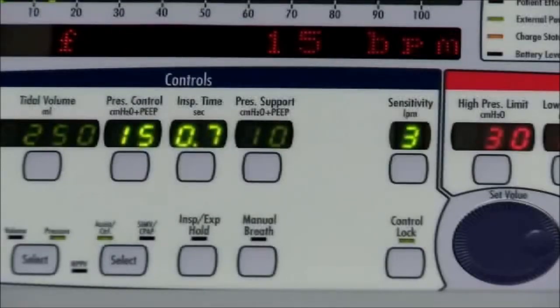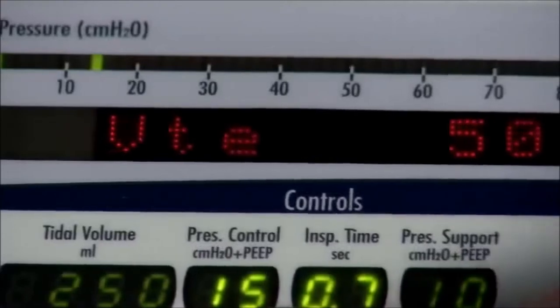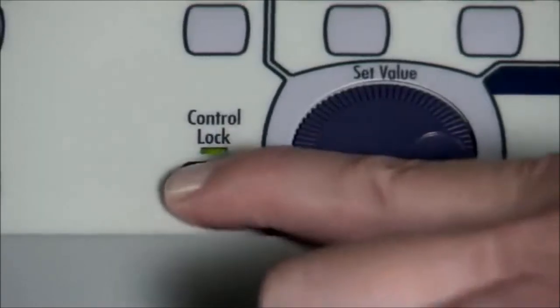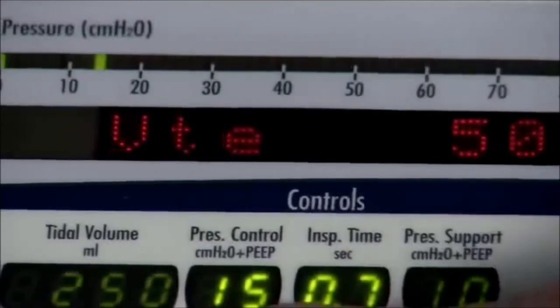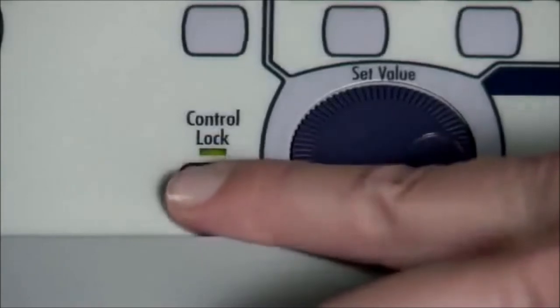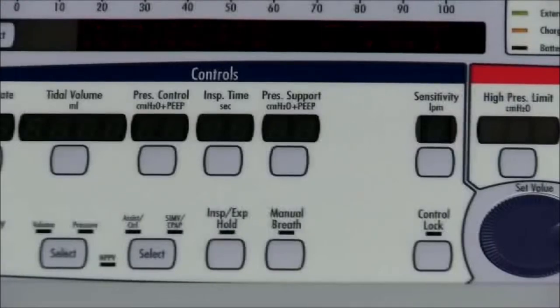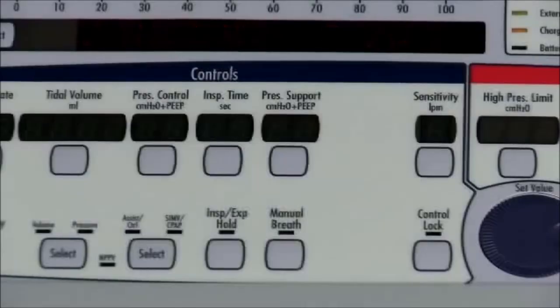The locked message is displayed when a button is pressed while the controls are locked. No audible alarm is given. The locked message is flashed in the display window for 5 seconds or until the controls are unlocked. To unlock the controls when Easy Unlock is selected, simply press and release the Control Lock button. To unlock the controls when Hard Unlock is selected, press and hold the Control Lock button for 3 seconds. The Remove Patient Alarm occurs when the ventilator is powered up in the ventilator checkout or maintenance modes, reminding you to remove the patient before proceeding since the ventilator does not deliver gas during these tests. To reset the Remove Patient Alarm, press the Alarm Silence button twice.